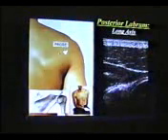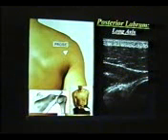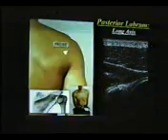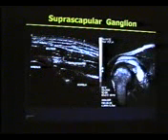For the posterior labrum, we scan the patient sitting in this position, and we scan from the back. We put our probe at the back of the patient, and this is the posterior labrum in long axis. A panoramic view for infraspinatus, scapula. This is the suprascapular nerve along with the ganglion, a ganglionic cyst which was confirmed on CT and MRI.